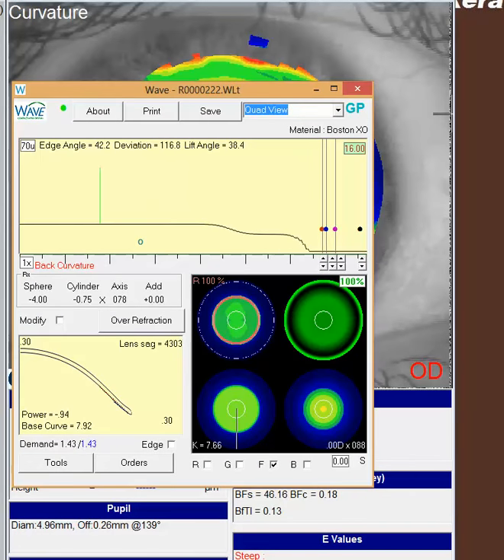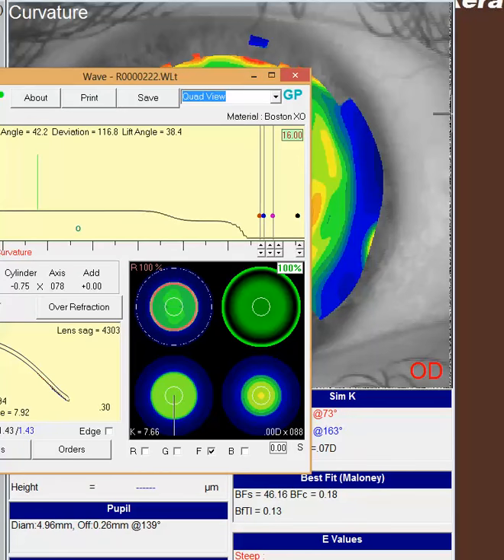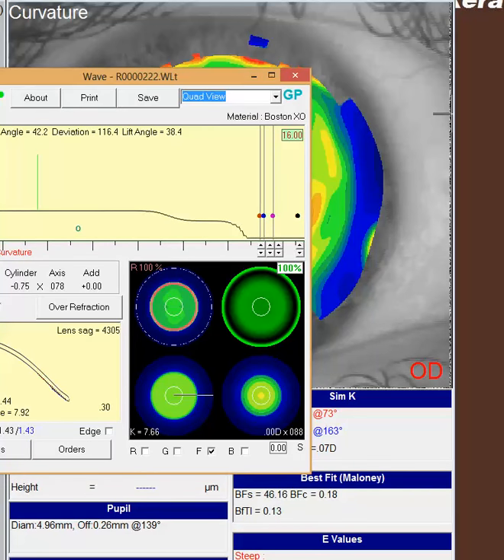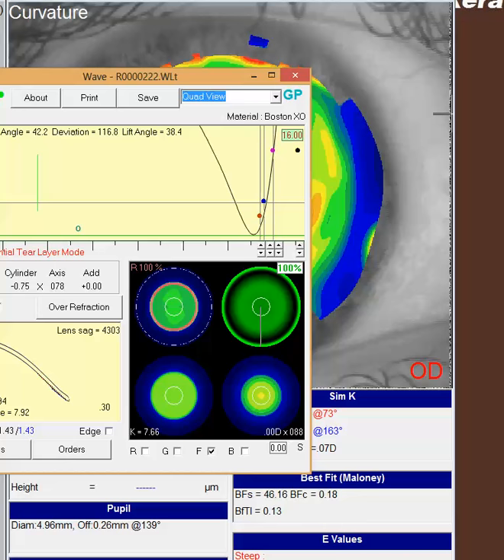As far as the bifocal add, that of course doesn't make a whole lot of sense. As you know, if we put a bifocal in here, we're probably going to get some interaction with this optical zone. And you didn't quite specify whether it was a center near design or a center distant design. Certainly, if you're not successful doing this, you could try and incorporate a little bit of bifocal. If that's the case, you may want to see if you can simulate the size of the soft lens that you were working with.